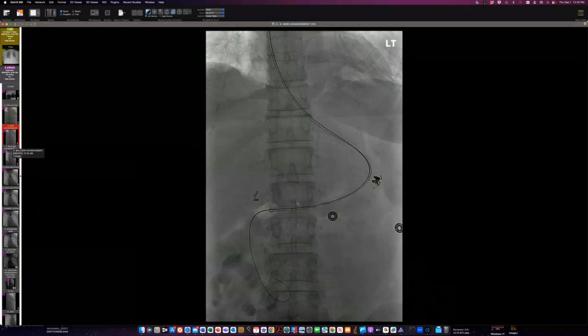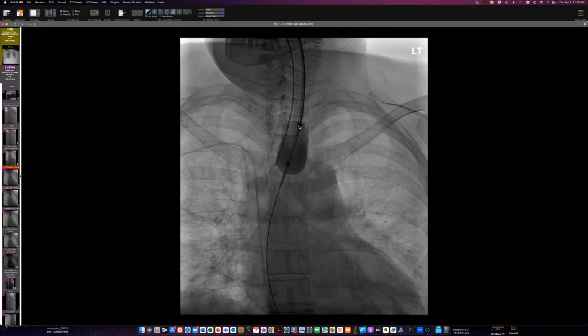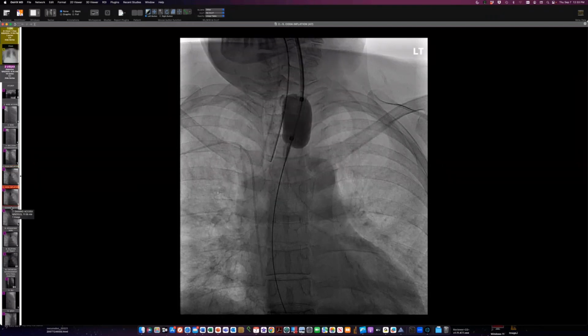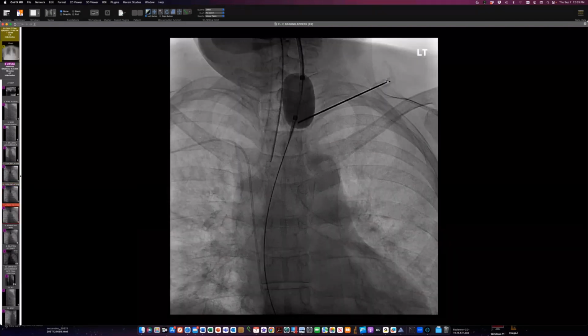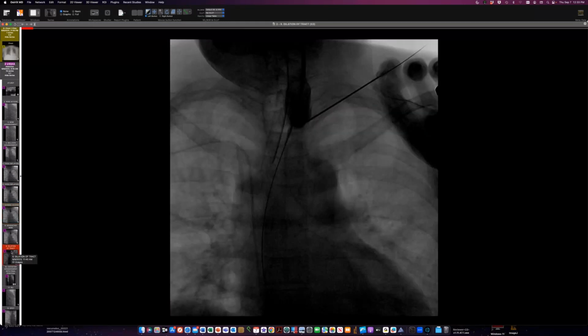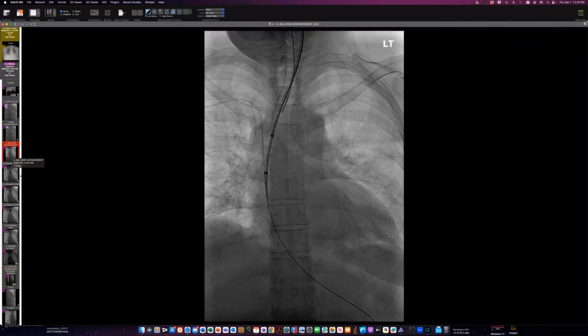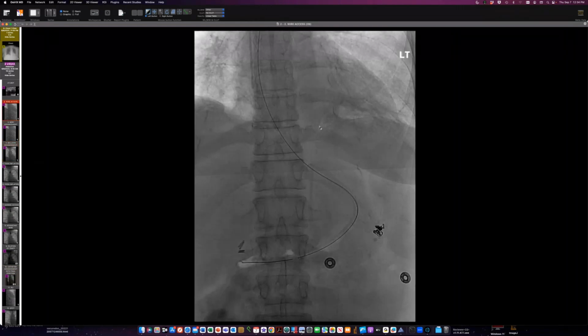This is the placement. So initially they put a balloon down in the esophagus and they inflated it. So there's contrast in the balloon here. And then I think they used that as a target and they stuck a needle in from the side here to get into the esophagus. And they threaded a guide wire down, and eventually they were able to get a pathway going down here, and then they threaded this tube over that. So this is interventional radiology resulting in this unusual tube placement, a tube coming in over the clavicles, but not coming down from the hypopharynx and above. So initially this person got an enteric tube in a conventional location, but it was a devious path to get there and required some intervention.